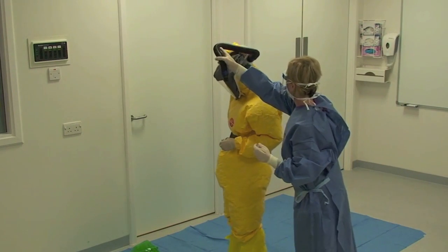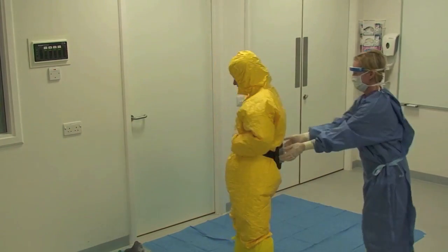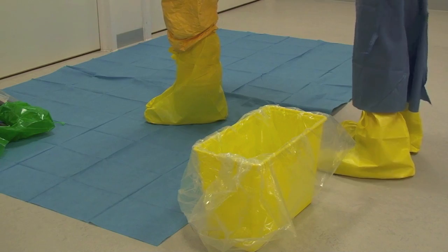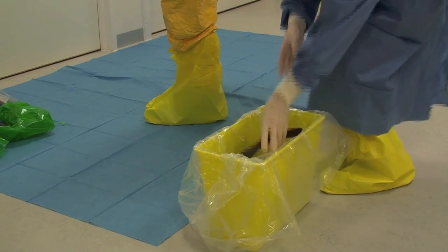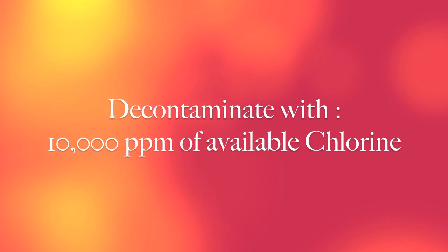The hood and the hose is removed and placed on the blue sheet. If the hose is contaminated with blood or body fluids then it should be disposed of as clinical waste. The battery pack should be placed into the plastic lined box and decontaminated with 10,000 parts per million of available chlorine as per protocol.